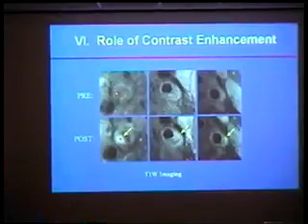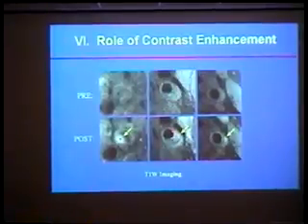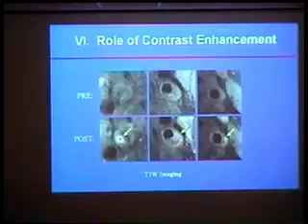In this case, the lumen is right here. It's very tiny, and then you have a giant plaque next to it. The layer next to the lumen is significantly enhanced, and then you also see the adventitial layer enhanced. This next case is even more interesting, an almost stereotypical so-called unstable plaque. The shoulder region of the cap has actually ruptured, and in this region there are pretty extensive microvessels, with significant enhancement. And this region is almost completely non-enhancing, and this is the lipid-rich region.